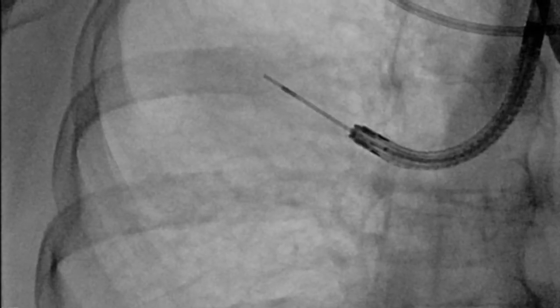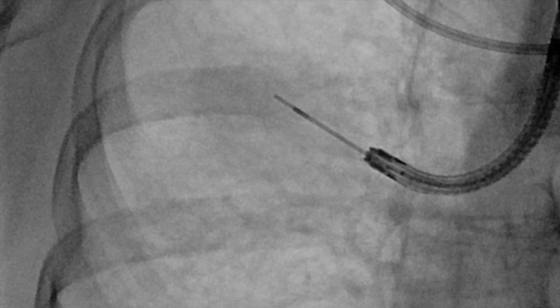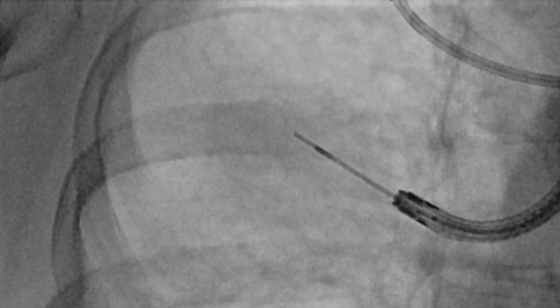The position of the probe and its relative location to the lesion and other structures is then confirmed using fluoroscopy. The image is saved for future reference.